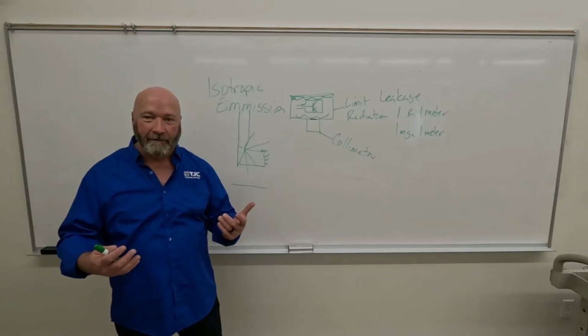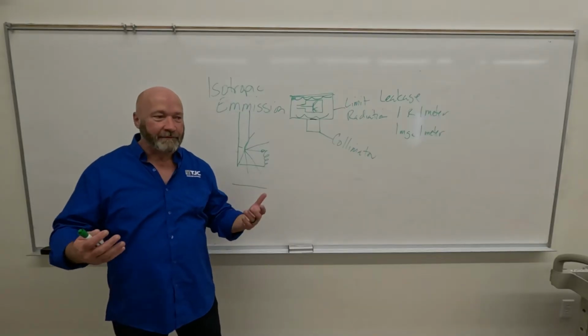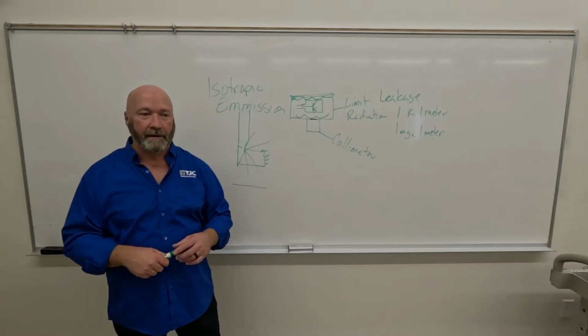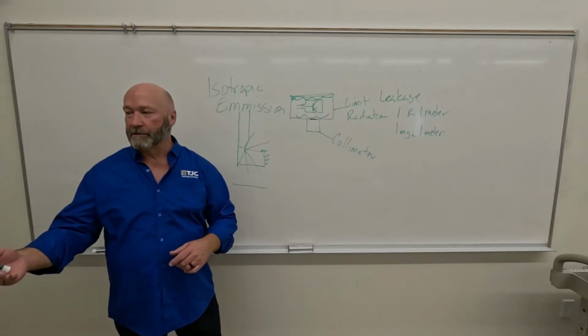It doesn't look like an envelope, you know? Just file it away. They call it envelope. So it can be either glass or metal. Glass is pretty traditional.